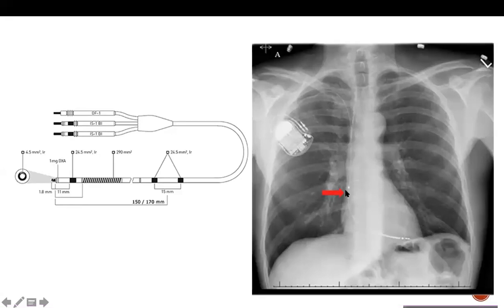Those are connected separately into an atrial screw and an atrial slot, and you could only use it for sensing. Interesting. So, for example, if someone has AV block, you could sense the atria and deliver ventricular pacing without the need of putting a separate atrial lead.